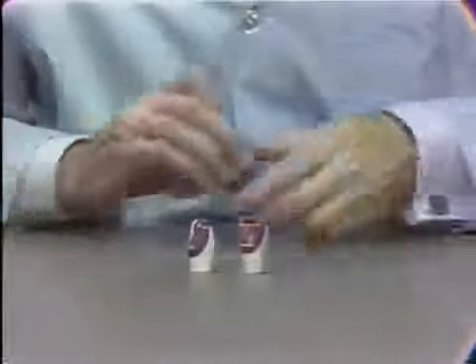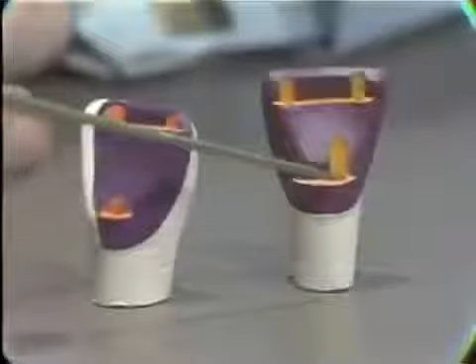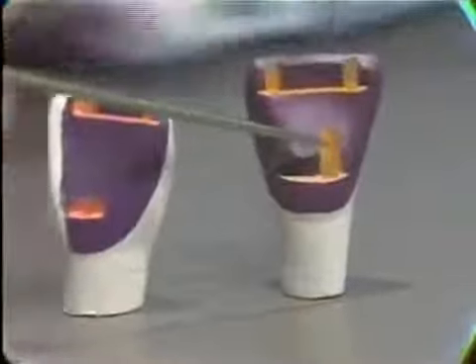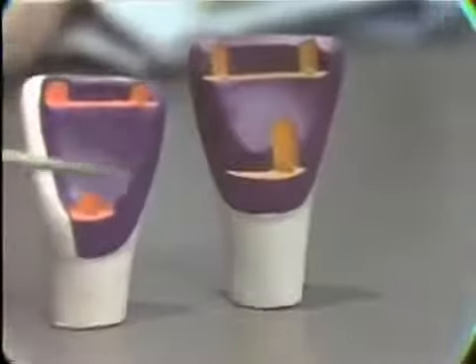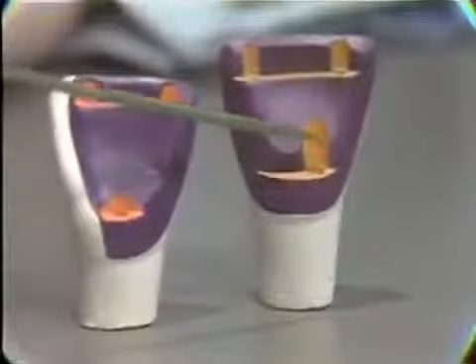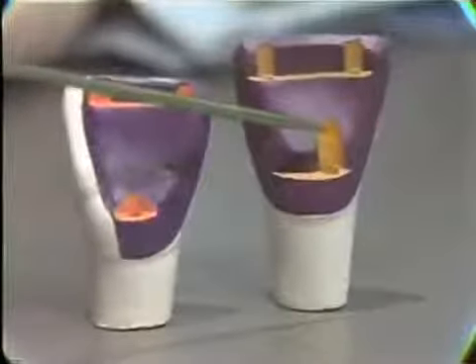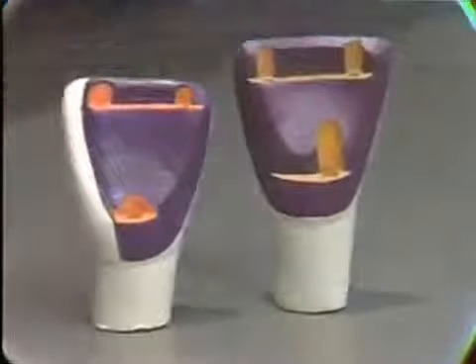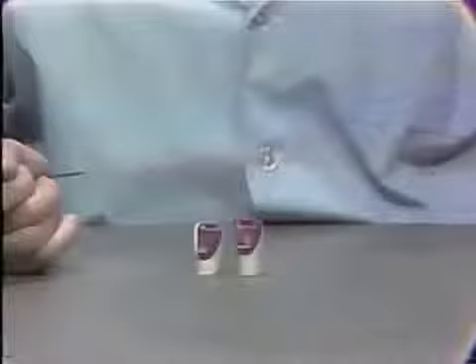It's sometimes convenient to modify the position of the cingulum pin, and in this model here we can see that the cingulum pin has been offset to one side. Here you see it in the central position. On this model here, it's offset to one side to avoid close proximity to the pulp in that particular situation.